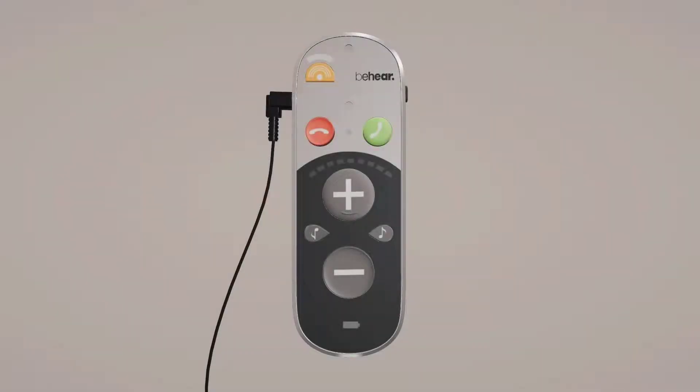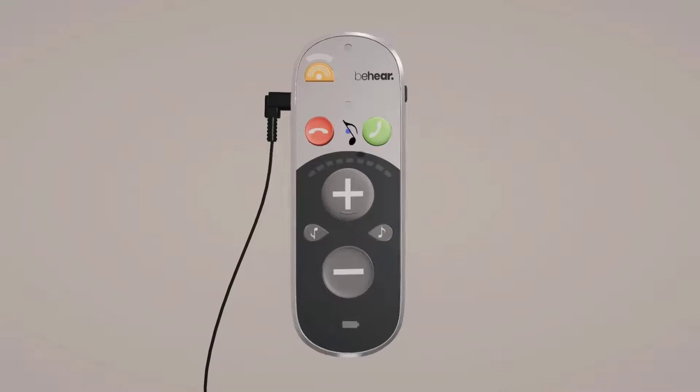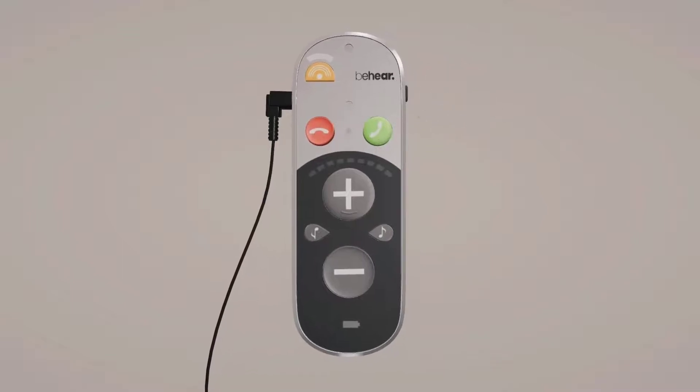Once Smarto has been paired successfully, the Bluetooth connection LED will be blue. Now all mobile and internet calls will be routed to your Smarto headset.